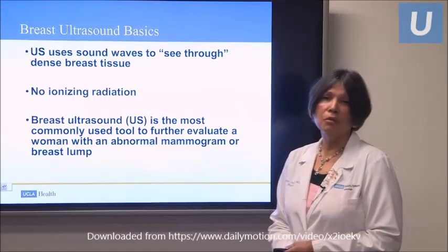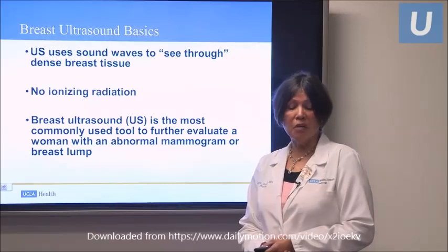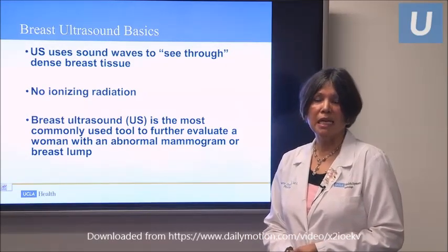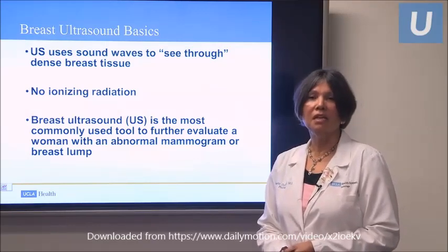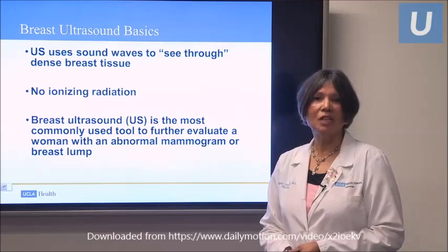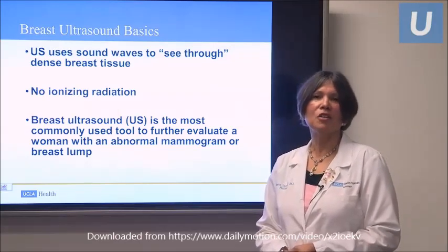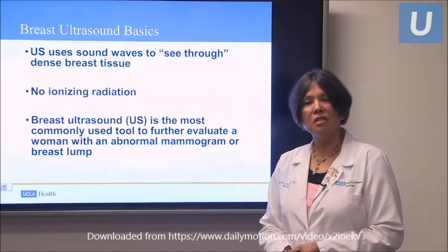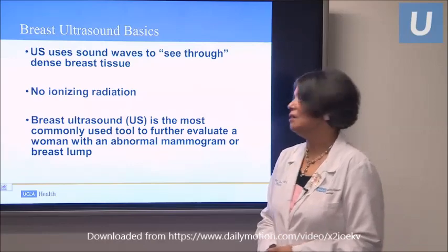And just to let you know, when we're doing the screening mammography, we call back an average of about 10% of the women. Again, that's because we're taking a three-dimensional object and putting it into two dimensions, and a lot of times there's overlap of tissue. So if you do get a call back on your mammogram, most of the time it is just overlapping tissue. But we further evaluate it with additional imaging and ultrasound.